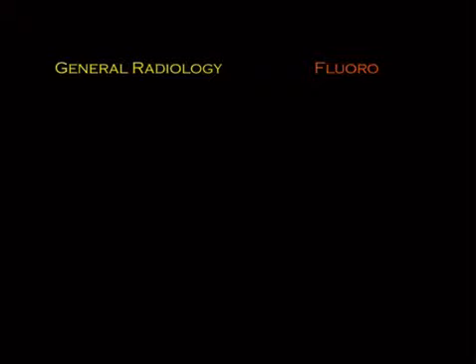Well, the difference is that whereas regular X-ray is done with a very high MA and a very short exposure time, the opposite is done in fluoro, where you have a very low MA and a very long exposure time, because you are going to be watching a dynamic thing happen. Now, the reason you have to lower your MA is that it reduces the chance of overheating so that it can stay on longer.